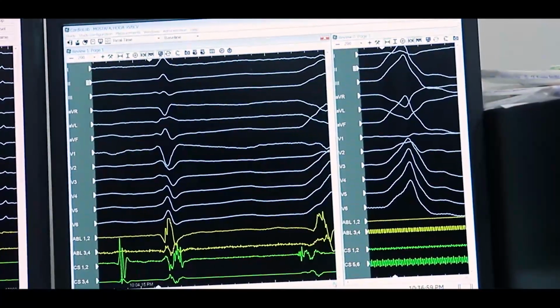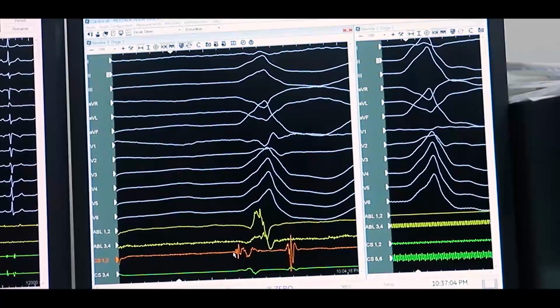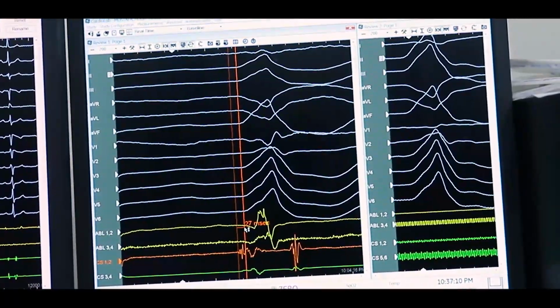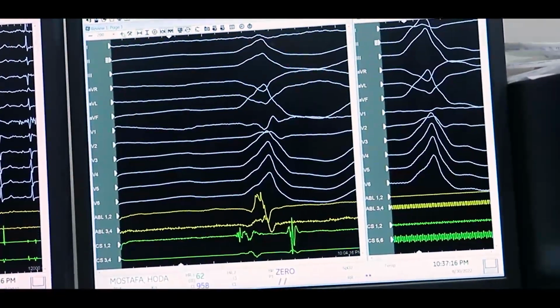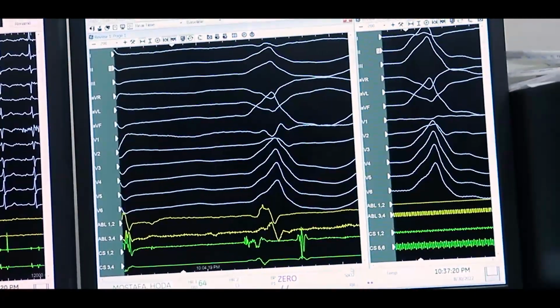Let's look at the PVC itself. Very spiky, very juicy potential. Measure, Anwar. More than 20. This is 27, a very good signal. This is my target. We were doing this by Carto, and Khaled will show us the Carto. This is the technique, how we think.